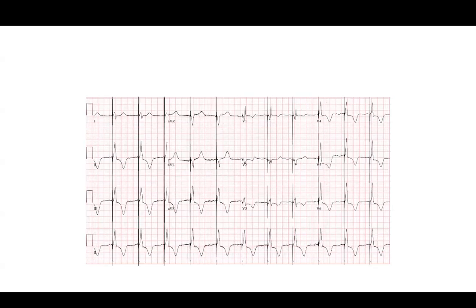It's just you're getting more, I always say more reach basically with a unipolar lead. That's true. You're just basically stimulating something further away. You're not right on it, but who cares in the end? I mean, you're getting, as I say, they call it the virtual electrode. It's interesting.